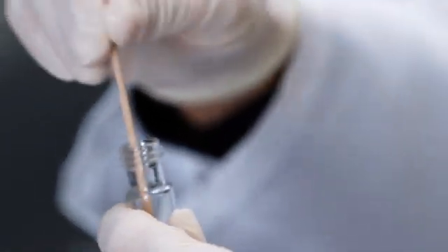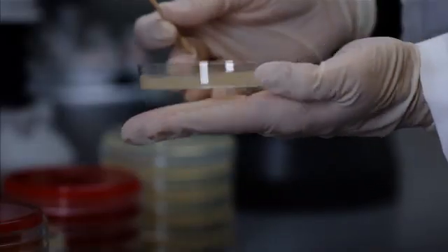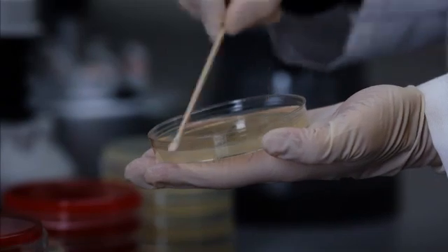Dip a sterile cotton wool swab into the suspension and remove excess fluid by rolling the swab on the edge of the tube. Inoculate the plate in at least three different directions to ensure there are no gaps.